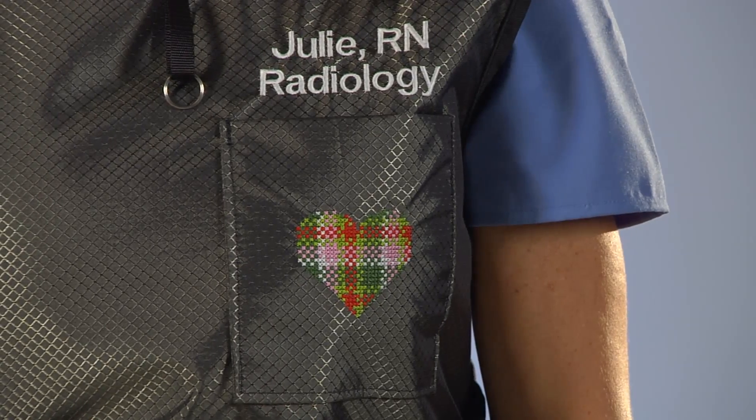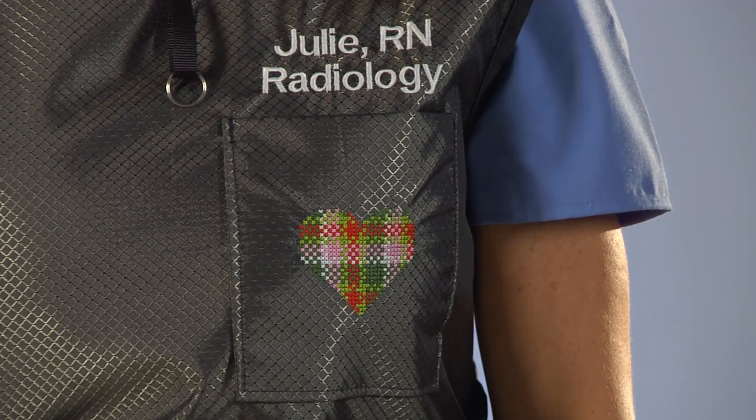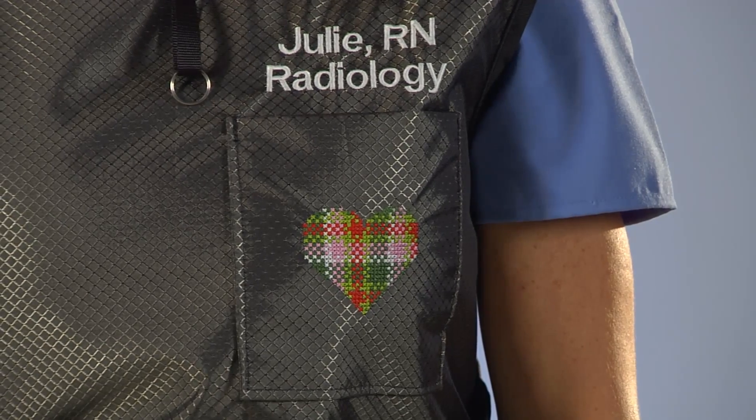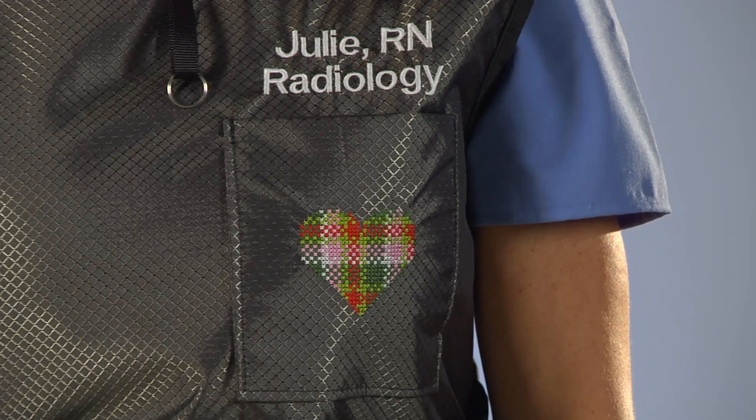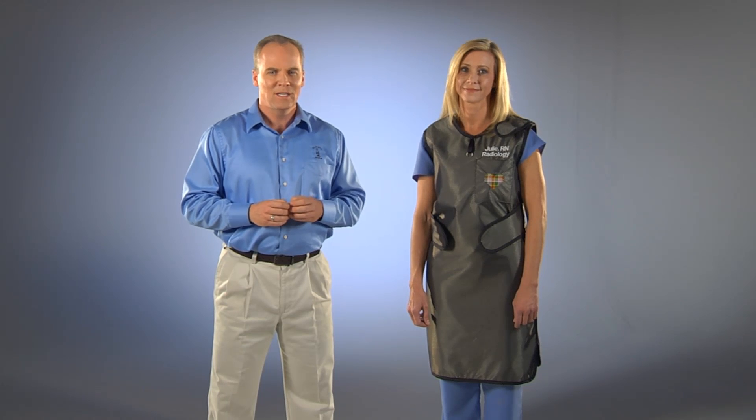The Euro One includes your choice of over 80 fabrics, a chest pocket, embroidered design, and two lines of embroidery text. We can also embroider your own logo for an additional charge. All of our aprons include a thyroid shield tether to attach to one of our thyroid shields. You can also get an additional film badge tether. The Euro One can be custom sized to your measurements to provide the best fit. Please see our measuring video for measuring instructions. All of our aprons are available in gender-specific standard sizes as well.